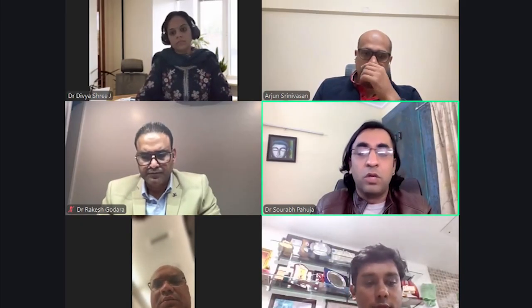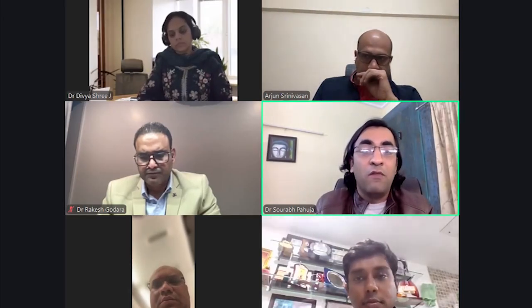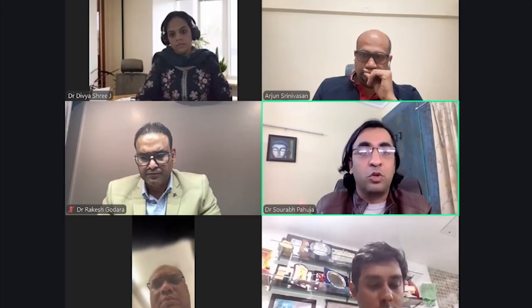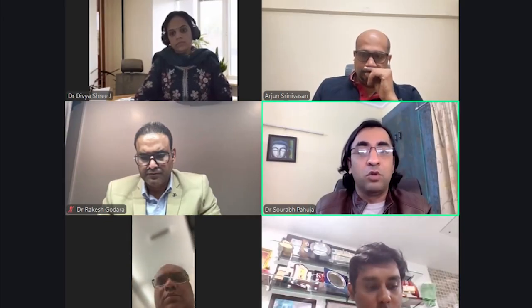And last, just 2 key points. Do not attempt these things alone. Always have a good interventional pulmonologist beside you, because once it starts bleeding, your mind goes blank, and sometimes you are not even able to judge what should be done next. So there should be a capable person standing with you, doing the intervention with you, who should be your support.